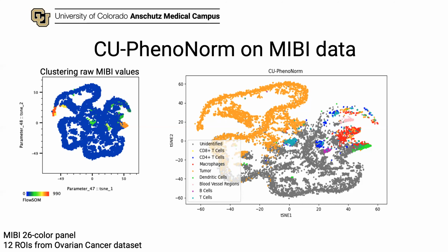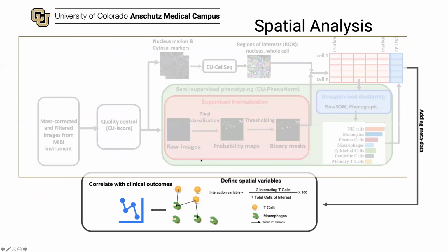Okay, so the whole point of doing spatial tissue profiling is to be able to take advantage of the spatial piece of the analysis. Otherwise, it would be so much easier to just do a flow cytometry or mass cytometry experiment if you have access to fresh tissue that you can break into single cells. Most people that do these kind of experiments are not taking advantage of the spatial analysis. So I really want to encourage, if you're thinking about doing any of these platforms in tissue, that you think about how am I going to use the spatial data.